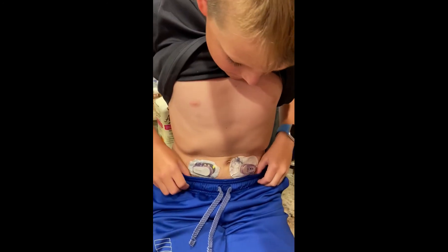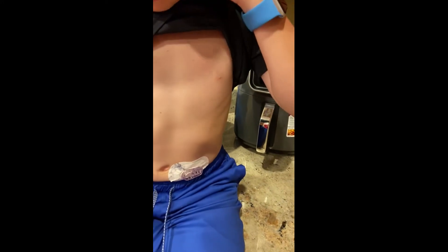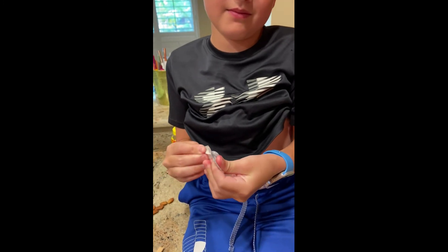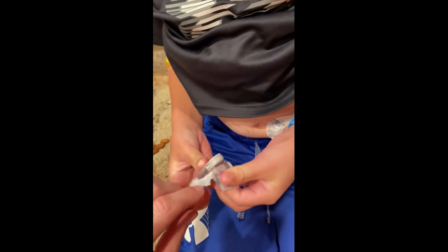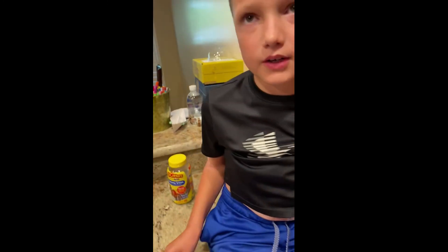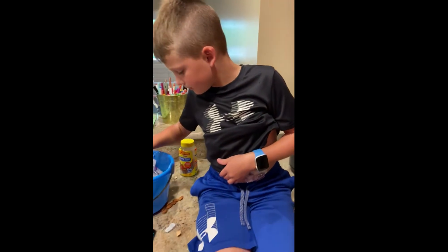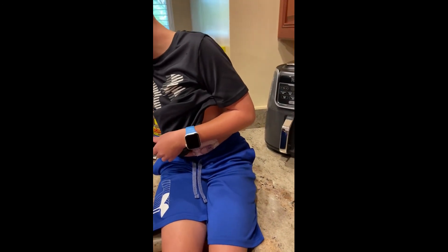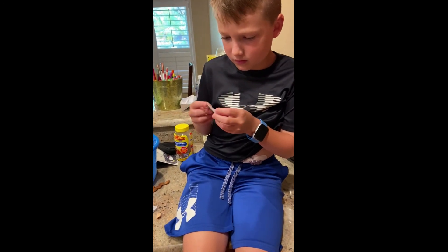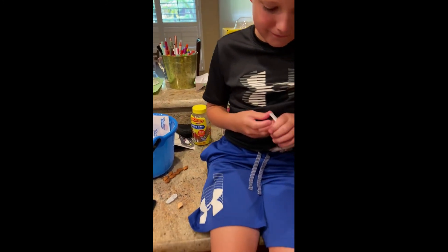So this is really important — he wants to hear about the two clicks when you take out the old one. So we take that off. Now we need to break this down, pull the transmitter out. Take an alcohol wipe and wipe down the actual transmitter — not the whole thing, just the back side — just to make sure it's good. You don't have to do this, but we do it.